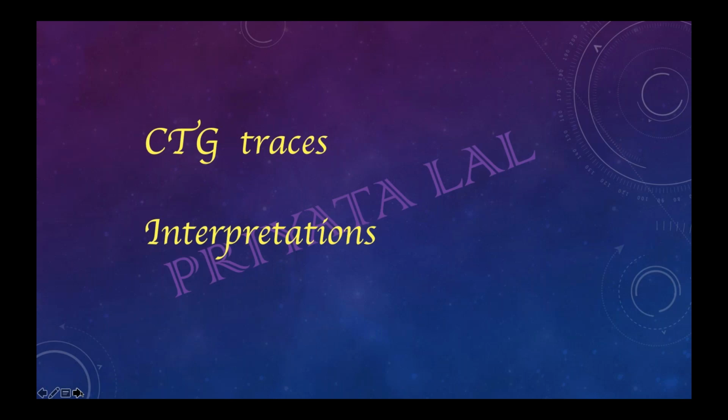But categorization will depend upon how many reassuring, non-reassuring, or abnormal features there are. If there is one non-reassuring feature, you will put that under suspicious.